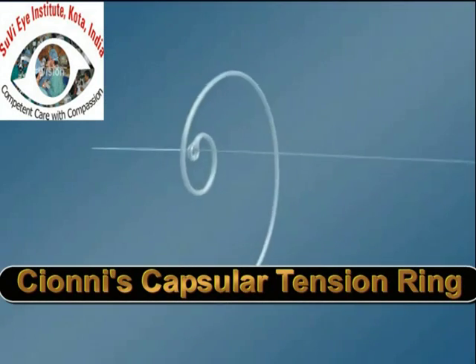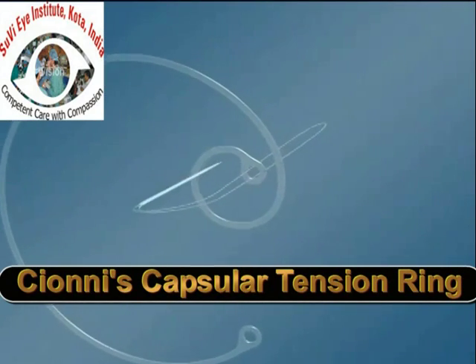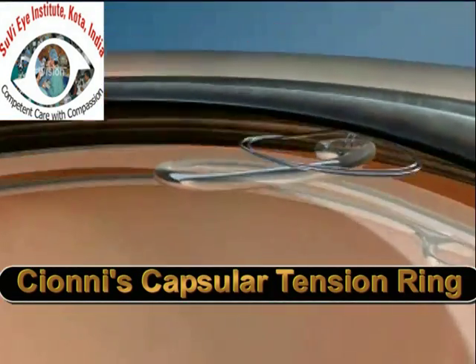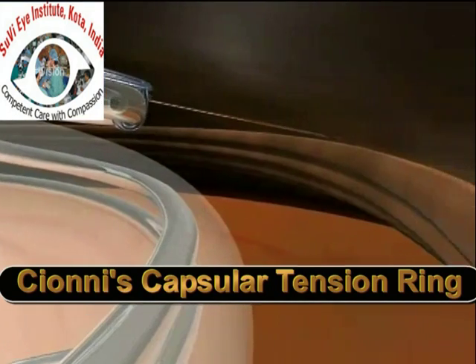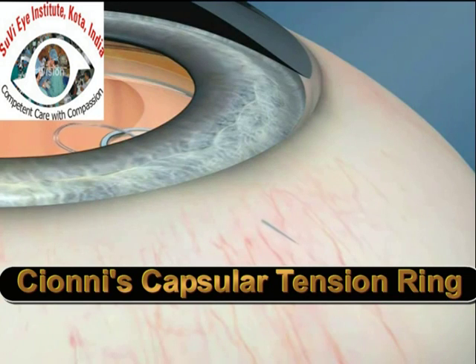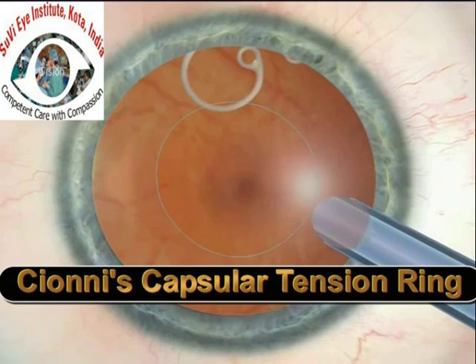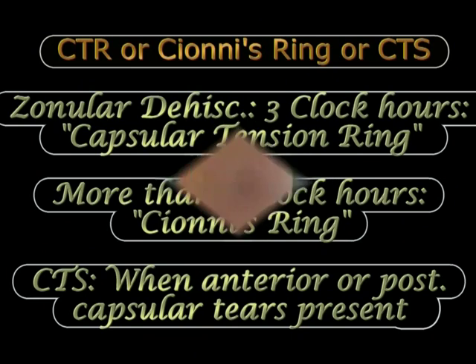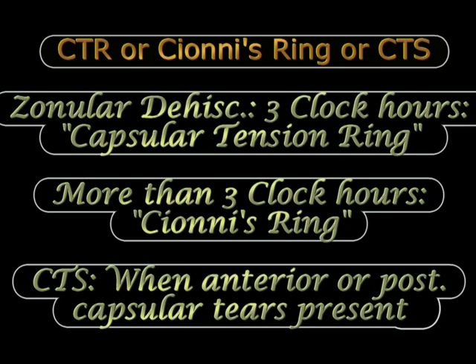For example, this is the Cionni modification of the capsular tension ring, where a hook projects out of a standard ring, protrudes beyond the capsulorrhexis margin, and has an eyelet that can be used to place a suture through the sclera. This provides additional stabilization of the capsular bag. Earlier techniques tried to pass sutures through the capsular bag itself, which was very traumatic; with this modification the hook projects out of the anterior capsule margin into the sulcus, and the eyelet is used to pass the suture.